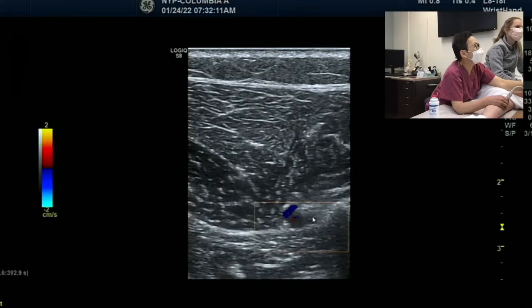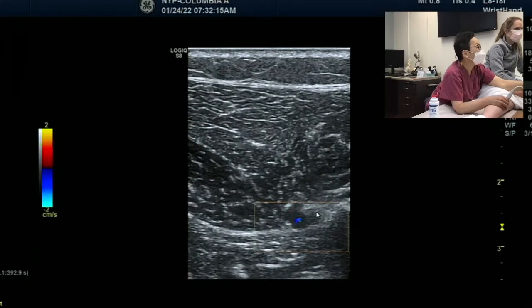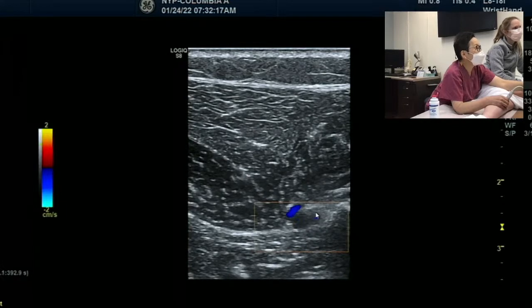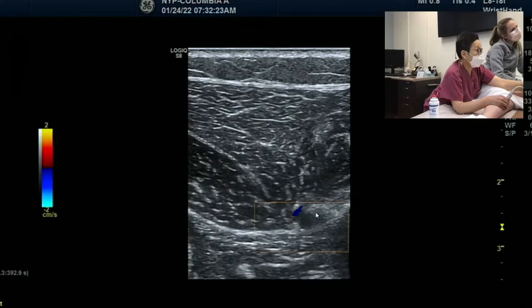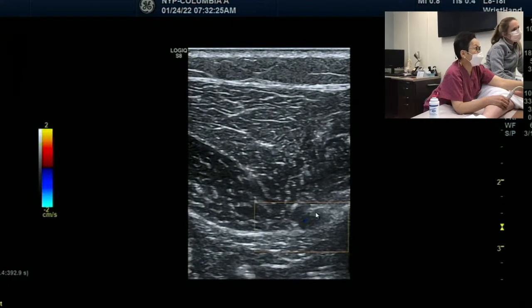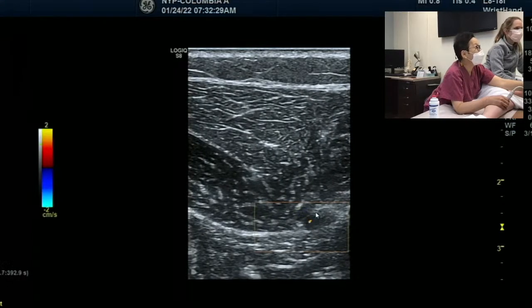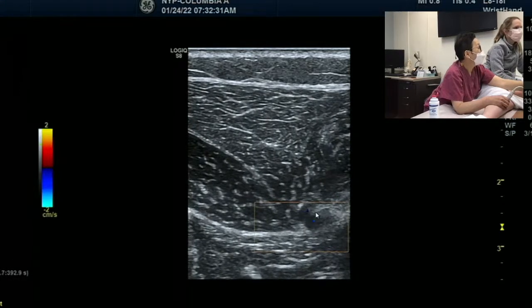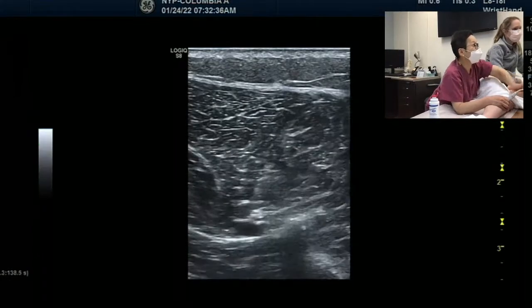So this is the anterior tibial artery. This hazy part is the deep peroneal nerve. The deep peroneal nerve is here, between the anterior tibialis and the EDL, but as you go down, it is underneath the EDL and anterior tibialis. We're going to get rid of the color flow.